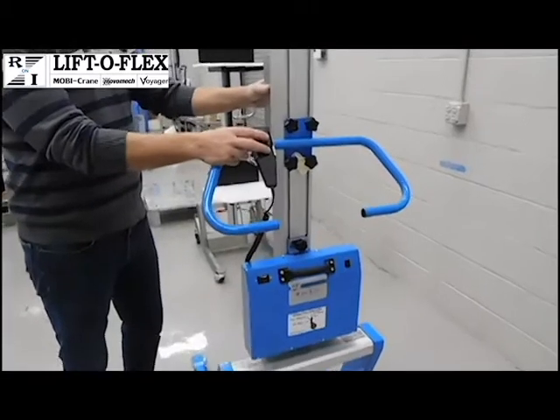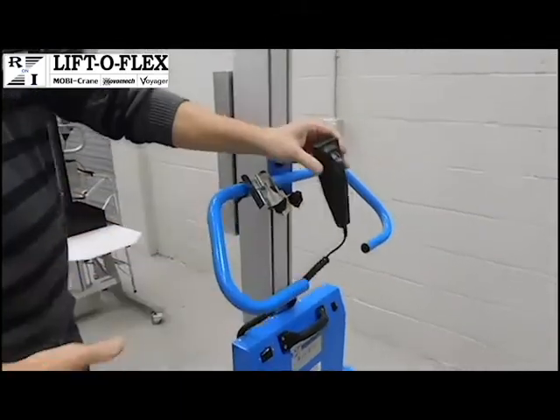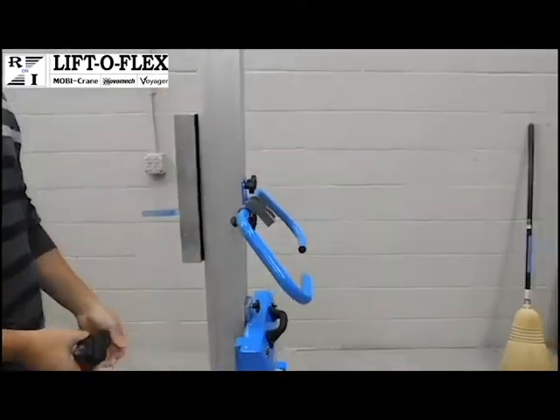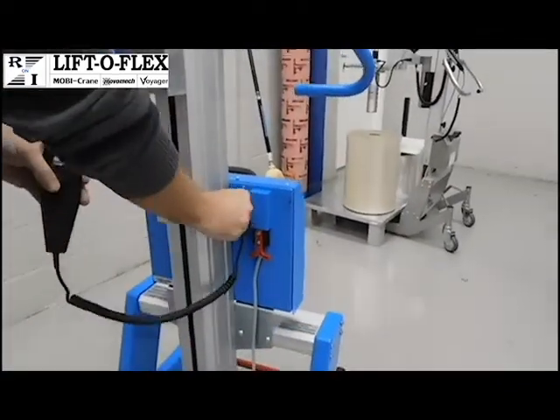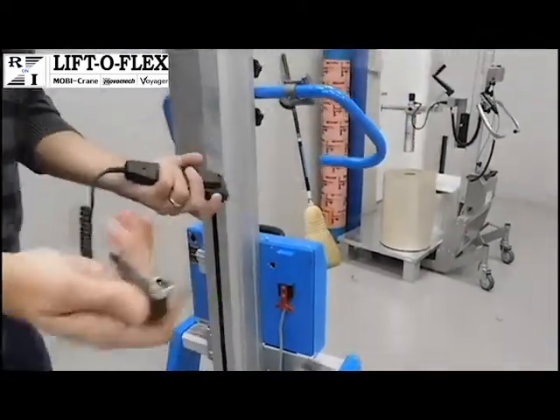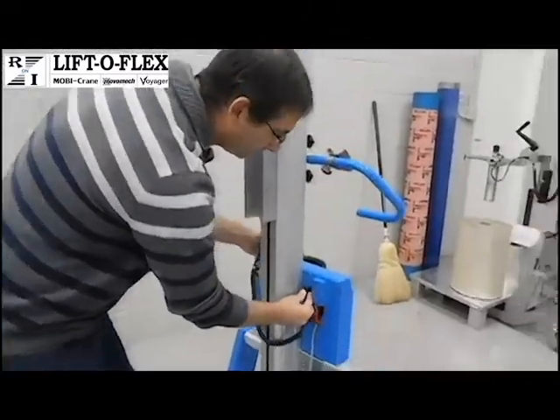The hand pendant, which controls up and down motion, would just come out of the handle holder that's on your handlebar. It's unplugged from the back of the power pack here. And then for replacing it, same procedure.